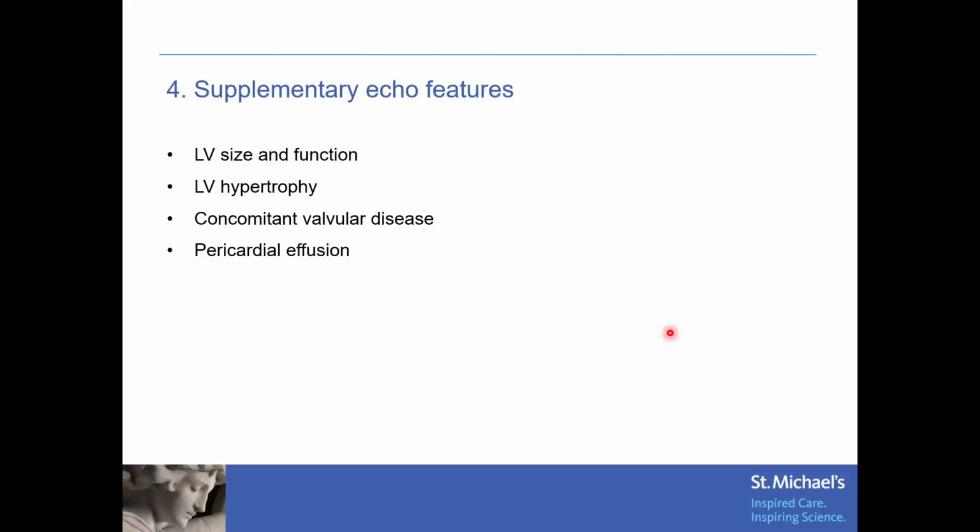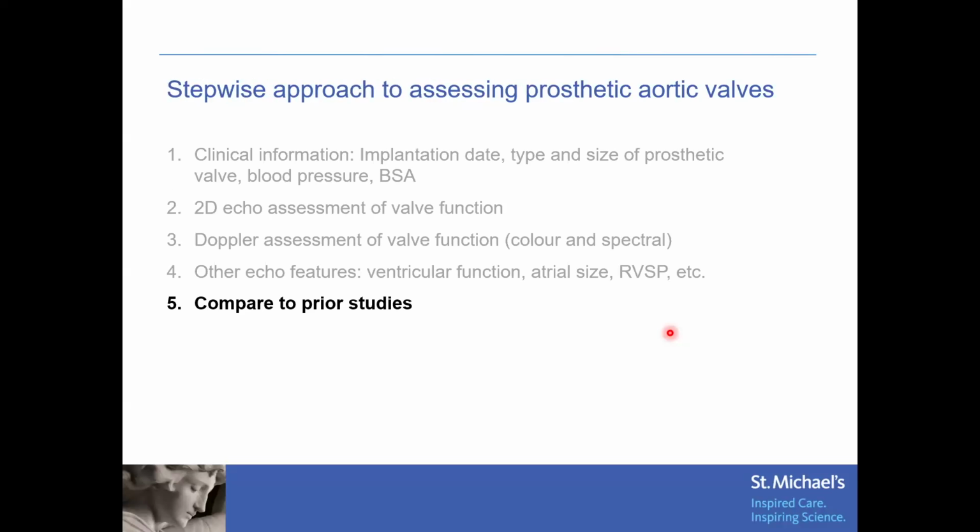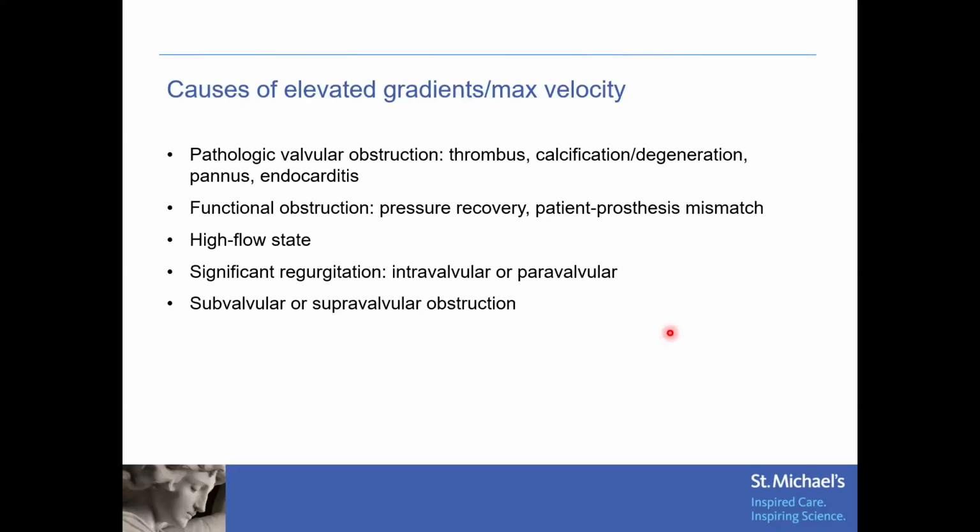And then for all patients with prosthetic valves, particularly immediately post-op, you want to think about whether or not the patient has a pericardial effusion. Just something to look for. And then, as pretty obvious, comparing to prior studies is also key.